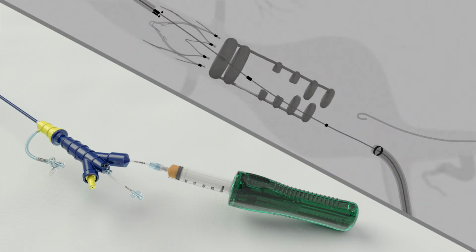Retract the aortic body guide wire to the radiopaque marker distal to the aortic body. The polymer is radiopaque, allowing the filling of the graft to be observed under fluoroscopy. During polymer injection, using fluoroscopy, intermittently observe filling of the graft with radiopaque fill polymer.